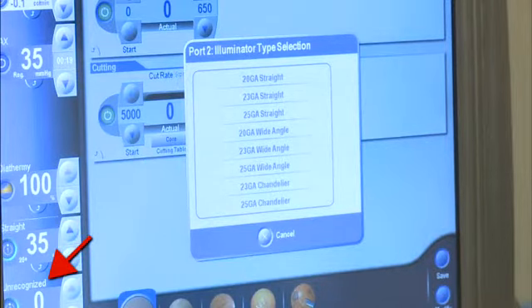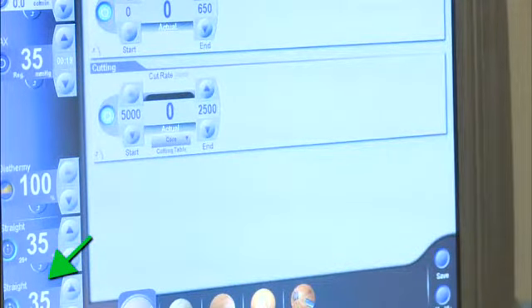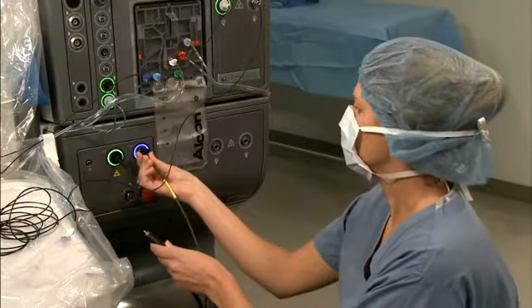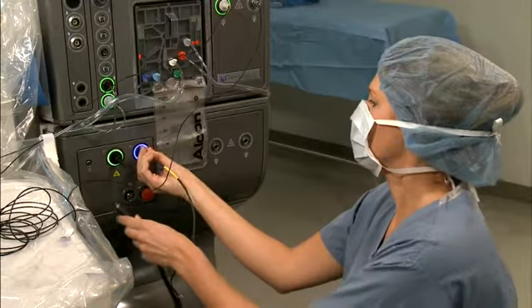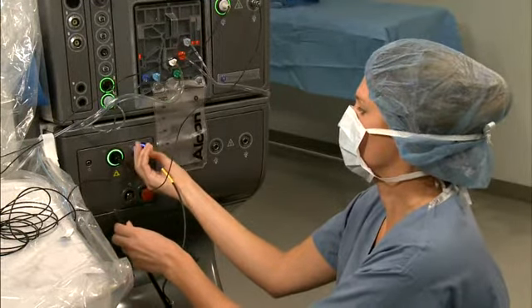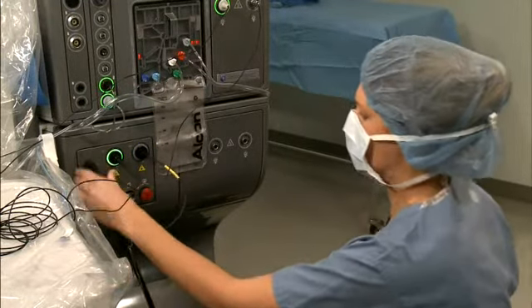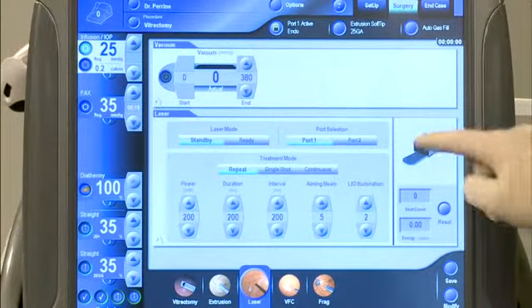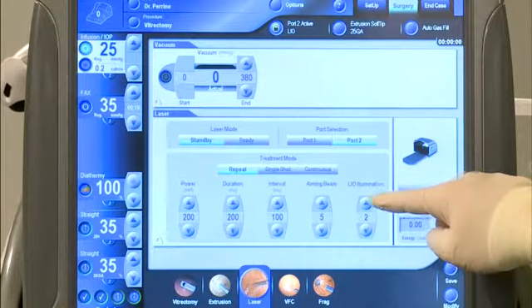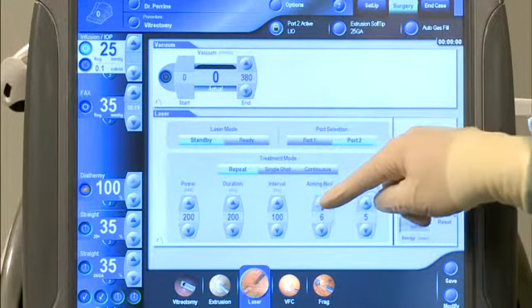In order for the Constellation system to recognize the illumination connector, select the appropriate illuminator type from the illumination type selection screen. The illuminator can now be turned on by pressing the appropriate illuminator button. To use the LIO, screw in the connector to the other laser port. The ring around the connection will not illuminate. Push in the white light connector of the LIO in the receptacle to the left of the laser ports. Select LIO by pressing Port 2 on the laser surgery screen. Laser parameters can be adjusted in the same manner as the endoprobe.